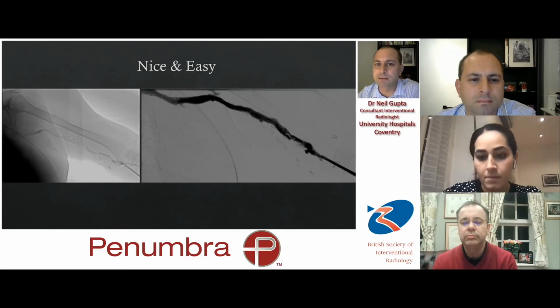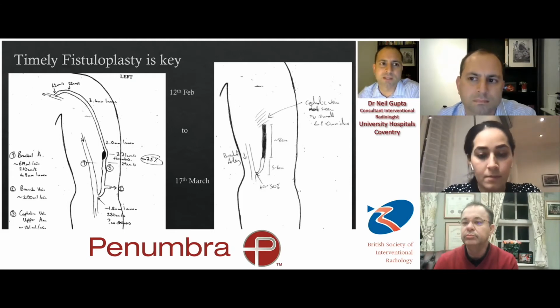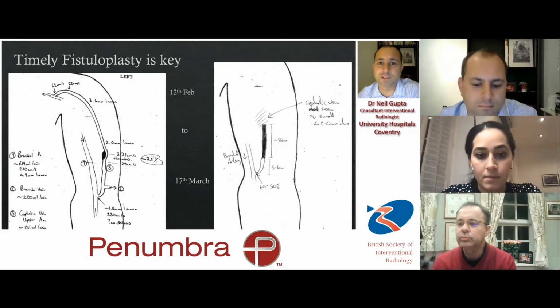And this is what you see. So you've got that sheath in the elbow in this instance. You've got that occluded segment with the patent segment higher up. You suck it out, plasty it out, and you then end up establishing flow. And the reason that you get this appearance is because if you look at the picture on the left, after a short distance on this patient, you've got a little collateral that flows off to the right, to the left of the patient. So sometimes you don't like this appearance because it's taking away blood flow from the main fistula, but it does protect that fistula when it thromboses, because it doesn't then thrombose and propagate all the way back to the anastomosis.